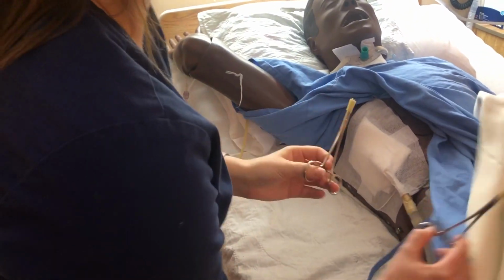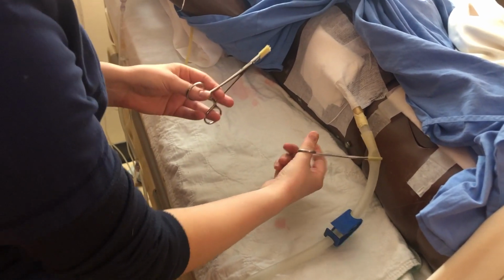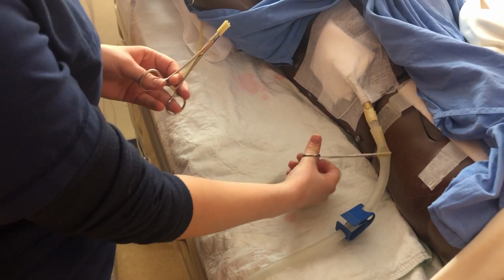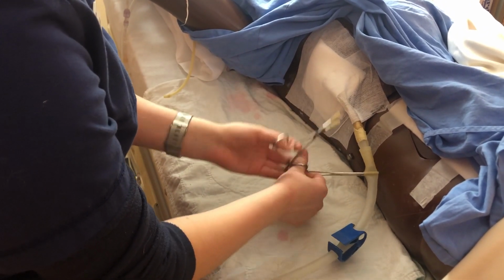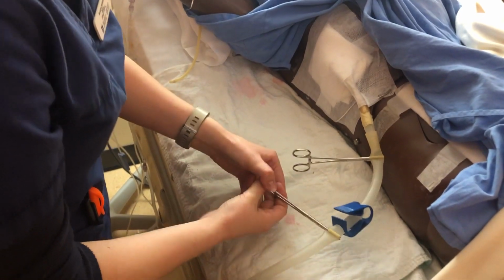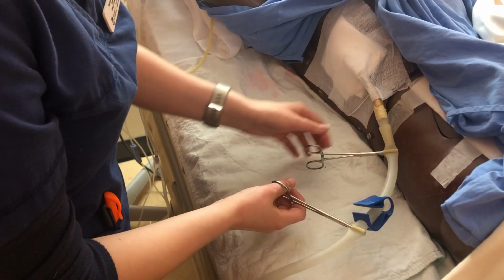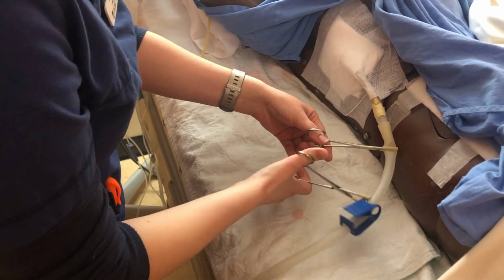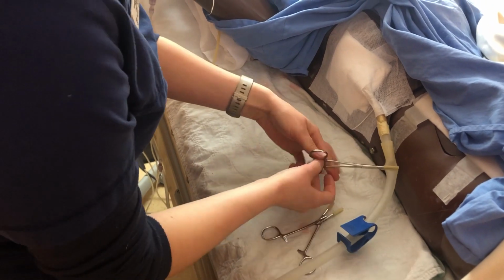So if an air leak was to occur, I'll just demonstrate to you what I would do. I would clamp the tubing, I would look in the window to see if the jacuzzi bubble stopped. If the jacuzzi bubble stopped, I know the leak is from here to the patient. If they didn't stop, I would clamp a little bit further down, check in the window, and if they stopped, then I know the leak is between here and here. Then you can just move your forceps down until you find the leak, and then you can tape it up with some waterproof tape.